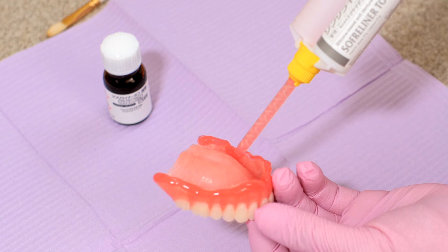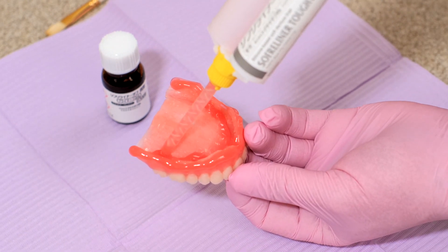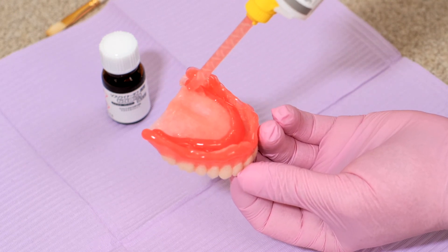Make sure to cover the entire denture surface where you applied the primer with the silicone paste to avoid saliva contamination of the primer. The contamination can result in poor adhesion of Soft Reliner to the denture.